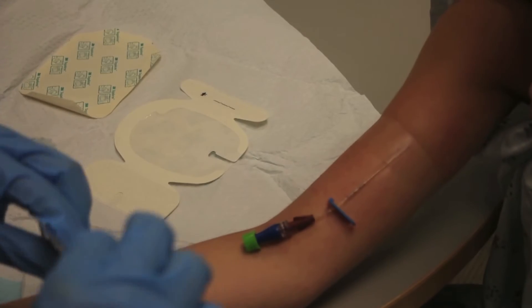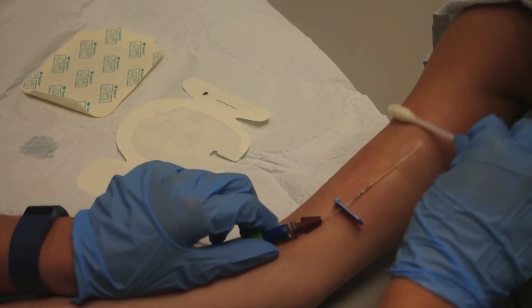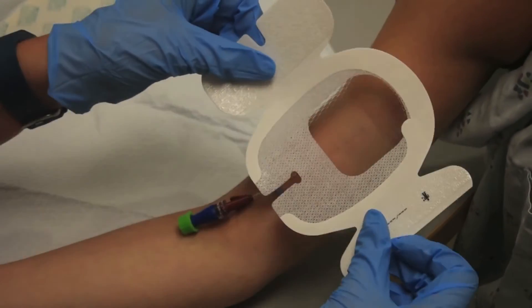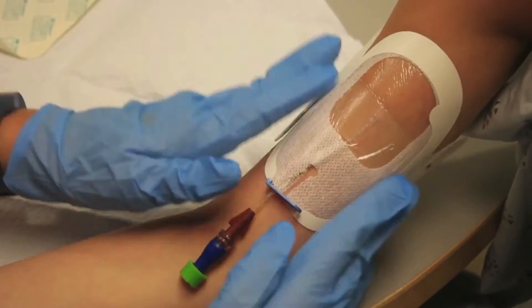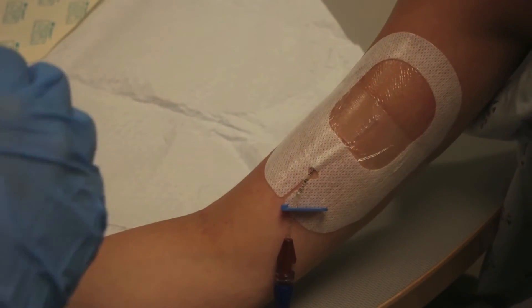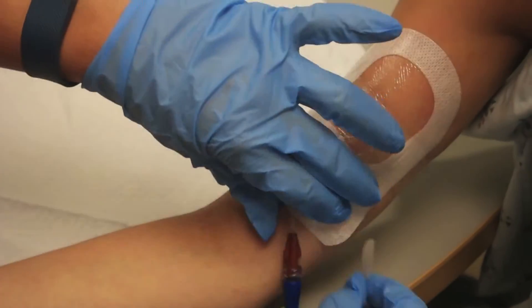Once the area is completely dry, apply skin prep and allow the solution to dry. Then you apply the sterile occlusive dressing. Tegaderm needs to be changed every 7 days or if soiled. Gauze dressing needs to be changed every 2 days or if soiled. Lastly, date, time, and initial your dressing.